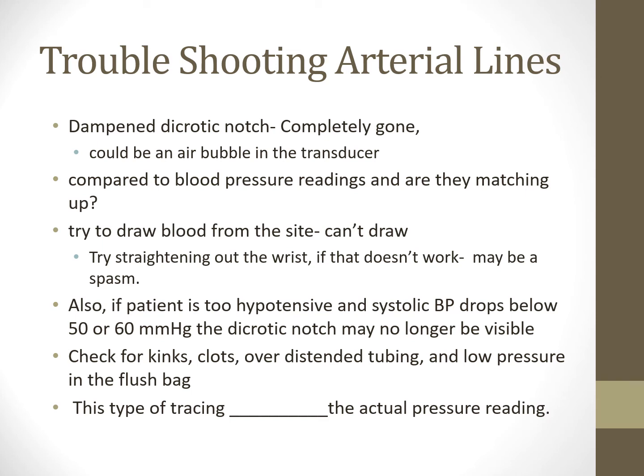This is something that you want to verify, because this person could easily be going into cardiac failure and you're catching it early. It sounds like if it's gone down to 50 or 60, then obviously you are in cardiac failure at that point, but you might catch it before their heart completely stops. The sooner you see that, the better, so that way you can work the patient before the heart completely decides to give up the ghost.